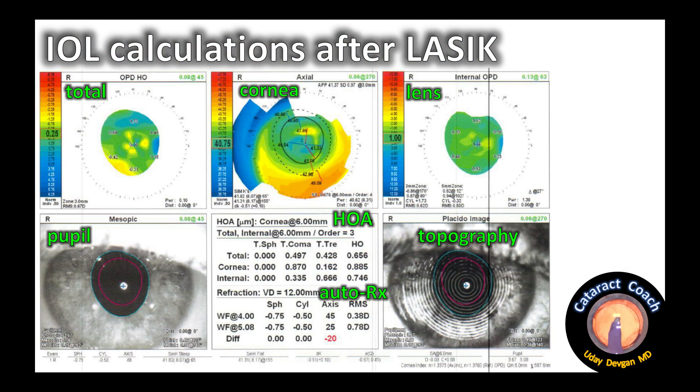This printout is from the NIDEC OPD scan. Starting with the top left box: that is essentially the refraction starting from the center of the pupil going out, and it's relatively uniform — about the same refraction measured in that central pupil zone. The top middle box is a topography of the cornea, an axial measurement, with a map and in the bottom corner the SIM K values. On the top of that box it says APP — that's the average power in the central cornea.